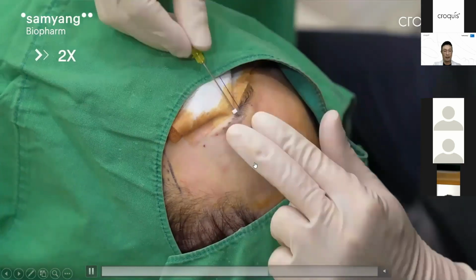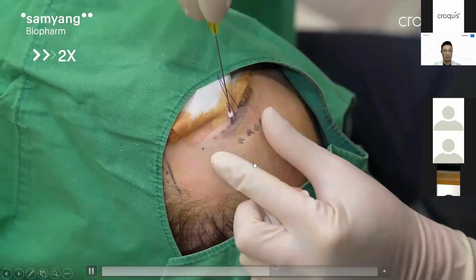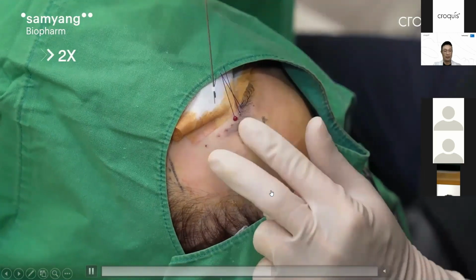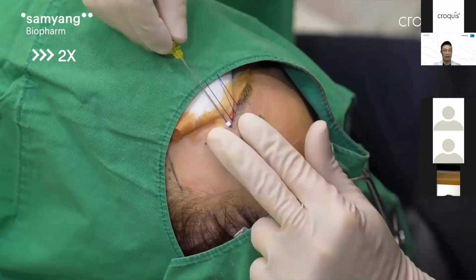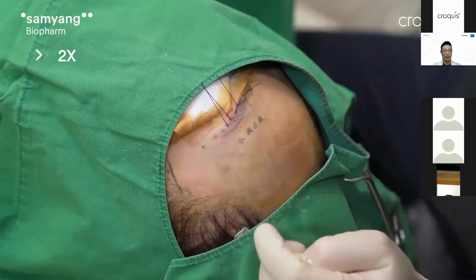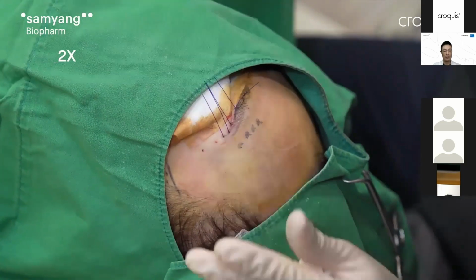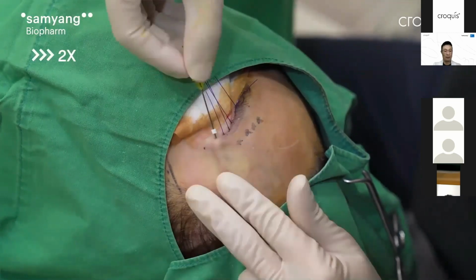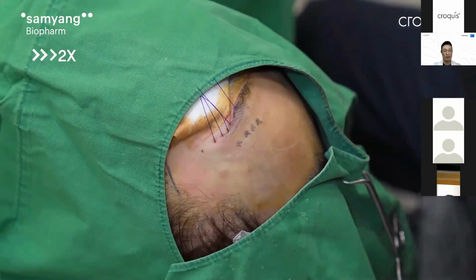Deep insertion, and right after insertion, you should keep your cannula more superficially. And then the last part, you can tense, you can lift up the cannula, and then the tip of the cannula will be facing downwards. And it will become easier to stick the cannula tips in the periosteum. It's not very difficult, but after 2 or 3 cases, you will be very familiar with this technique.